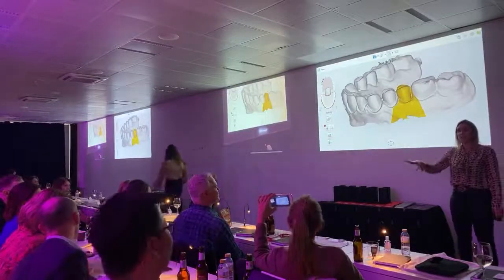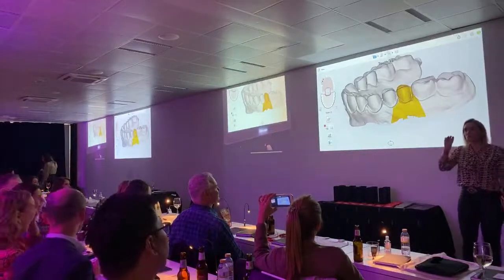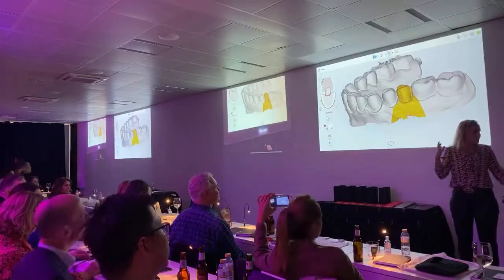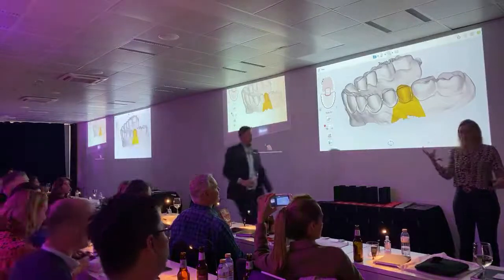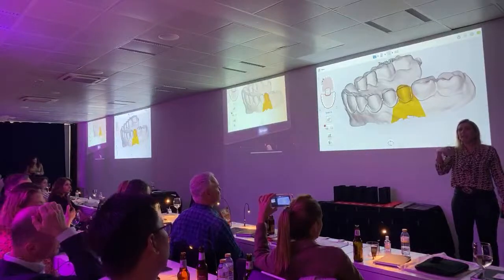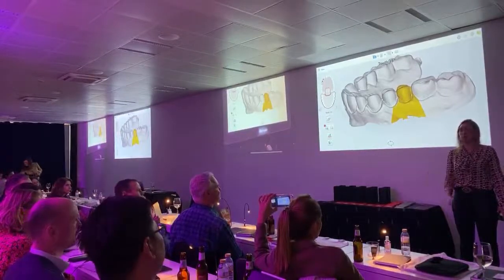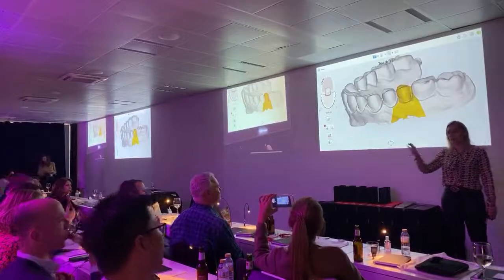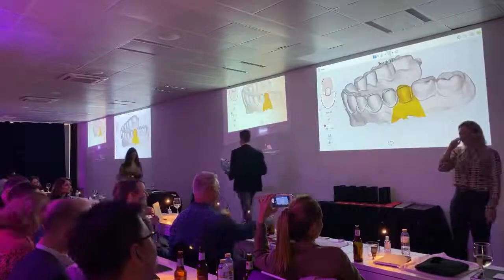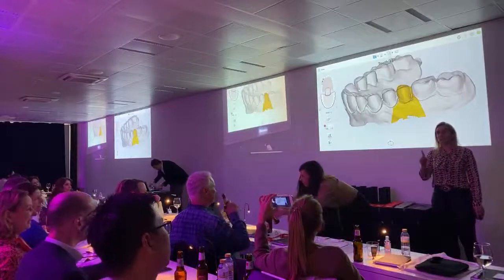All the CAD systems will understand because they are triangles. But sometimes one of those triangles, they will understand as a rhombus, or rectangle. It's gonna understand the sense, but in this area, you can have a misfit. But imagine if this is in the fitting line. This is a problem. So when you export the file, you have to choose in-lab. In-lab. Yes, you have to choose in-lab because this is what the DSD lab will work with, okay? So this is another important tip.